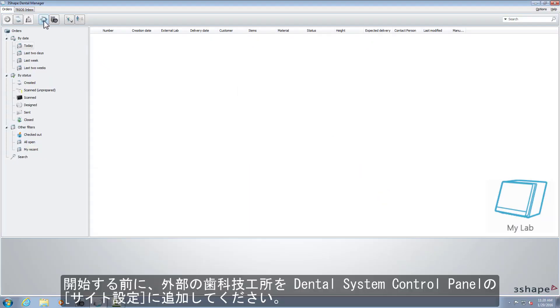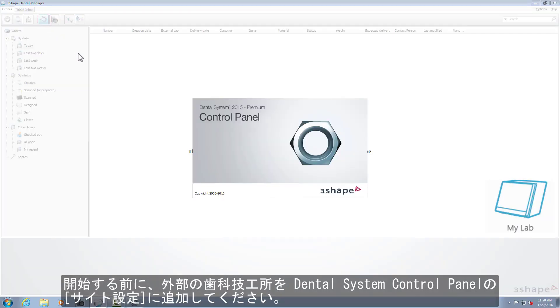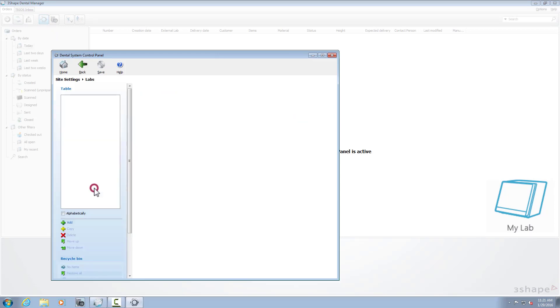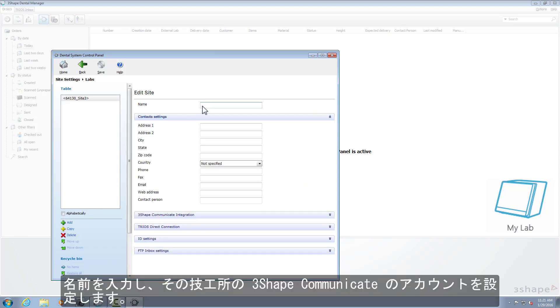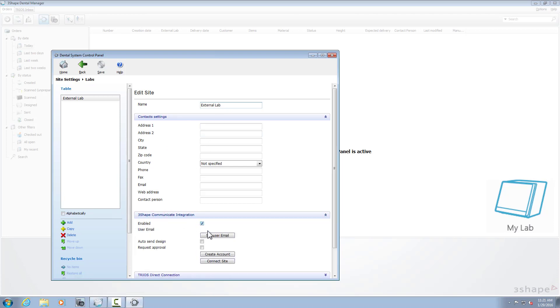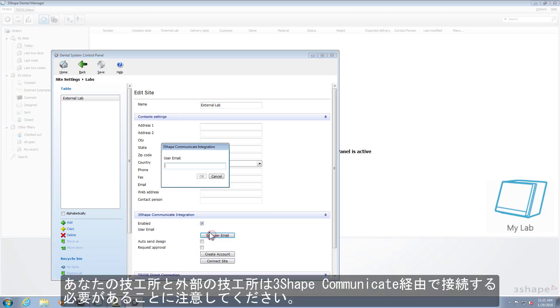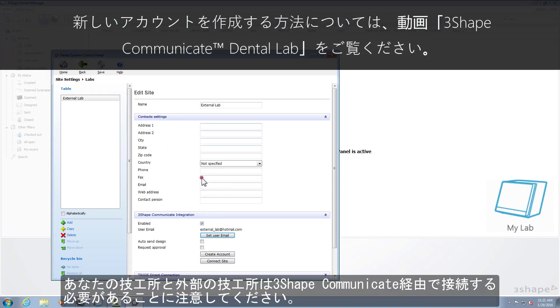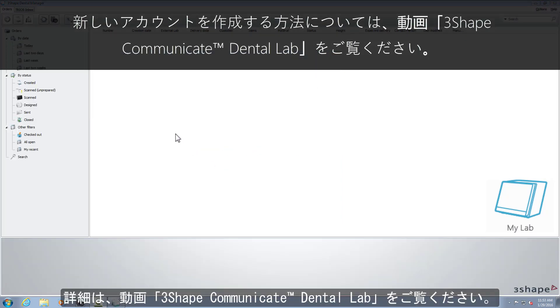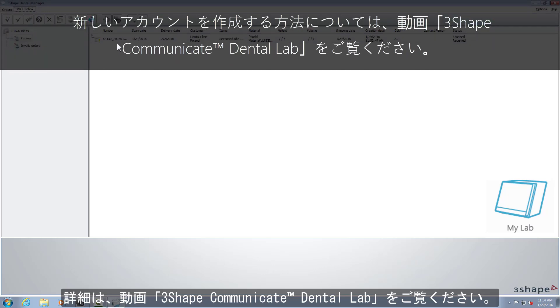Before you start, please add the external lab to your site settings in the Dental System Control Panel. Fill in the name and set the 3Shape Communicate account for that lab. Remember that your work lab and the external lab need to be connected through 3Shape Communicate. To learn more, please watch our 3Shape Communicate Dental Lab video.